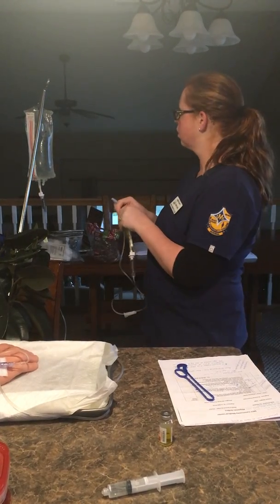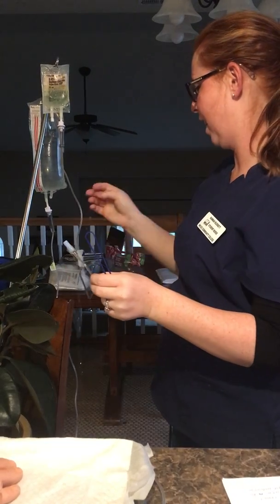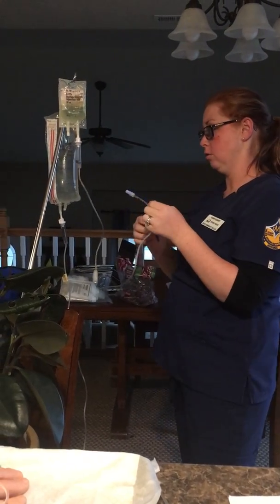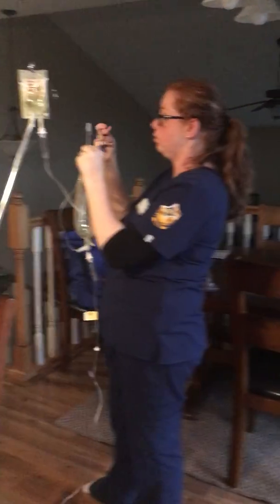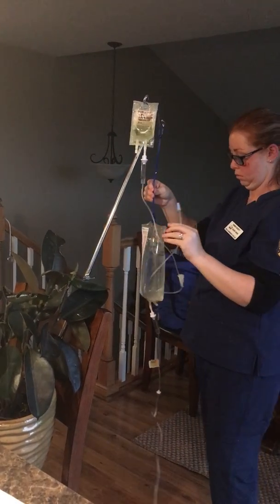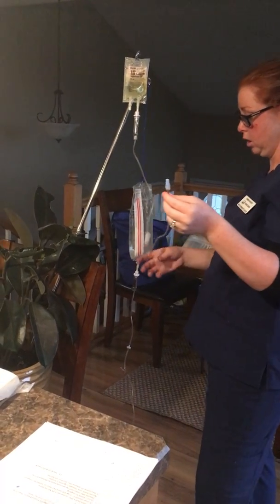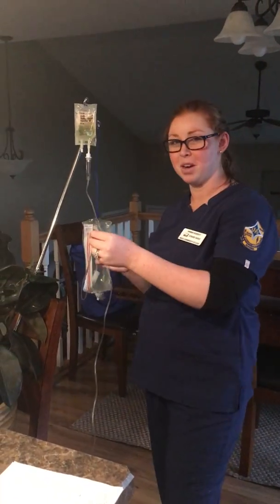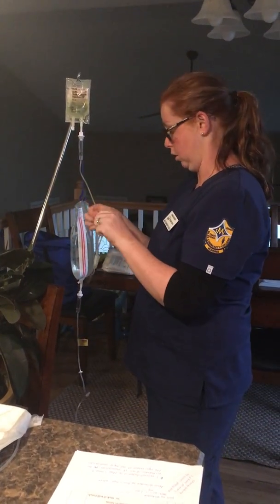I'll go ahead and open up my tubing and hang this. That's why you make sure this is closed before you hang it up — whoops. I'm going to use this to allow gravity to be my friend. Okay, and then with this being closed, I can uncap this and connect it, but since this has been out in the open, I'm going to clean it off really good first, both sides. I'll clean this too while I've got it out.